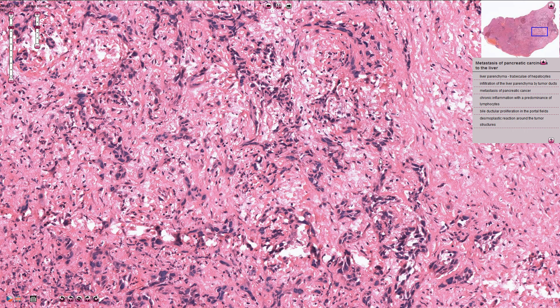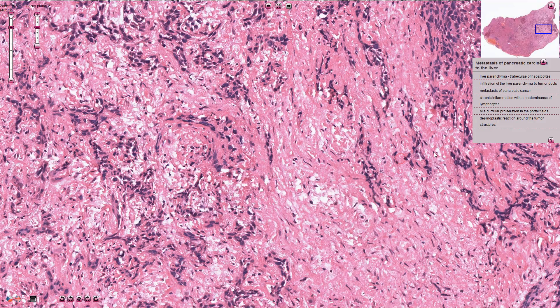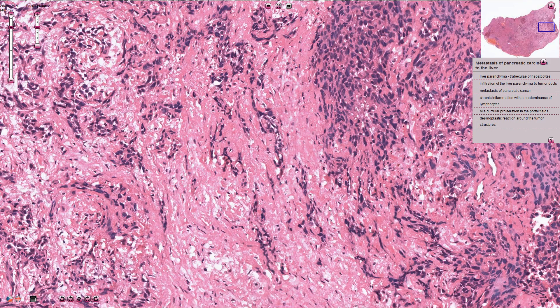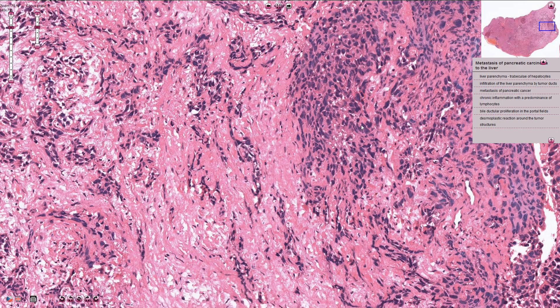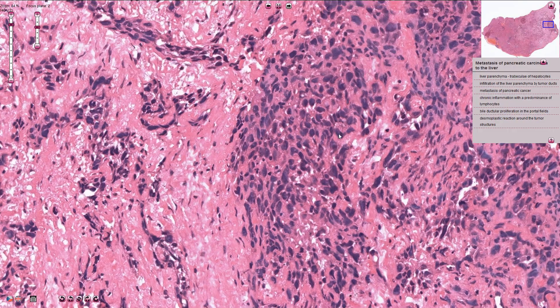The desmoplastic reaction is very prominent, and all of this pink tissue is the fibrous component of the tumor. In this part we can see the solid component of the tumor, which is composed of atypical nuclei with nuclear irregularities, smudged hyperchromatic chromatin, nuclear pleomorphism, and irregular nuclear contours.